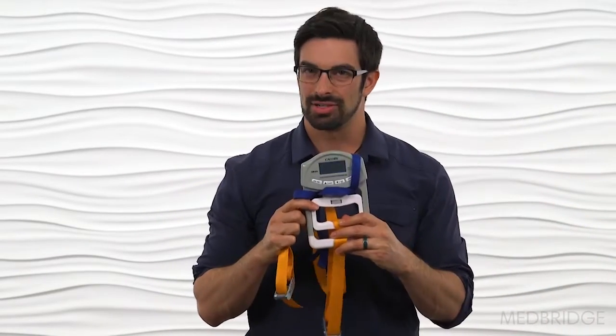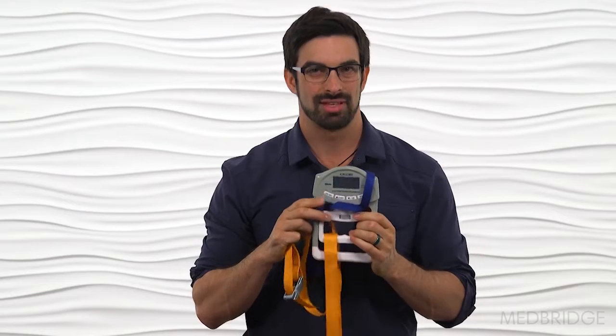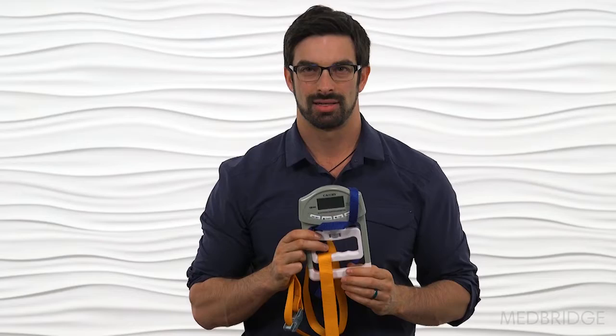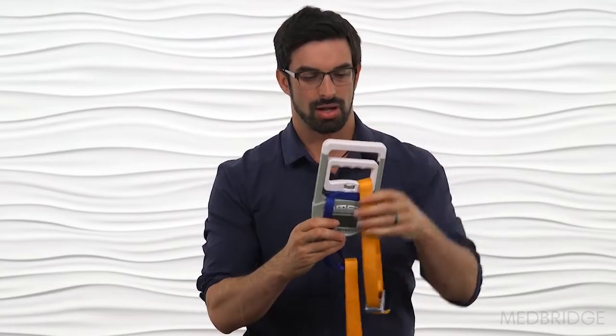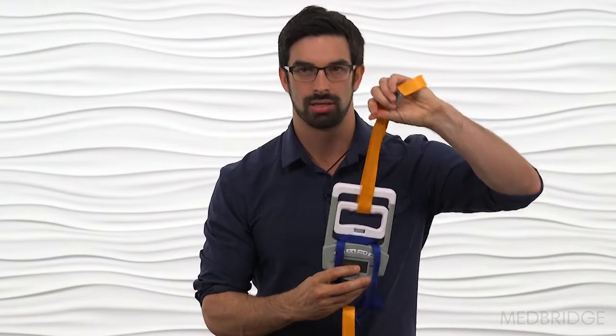The first unit is a standard grip strength dynamometer. Most clinics have these — you can find them anywhere. It's rigged a little differently than you would think. All I did was attach two pieces of webbing around the base of the dynamometer, then took a lashing strap — or you can use a mobilization belt from the clinic — and put that around the webbing.